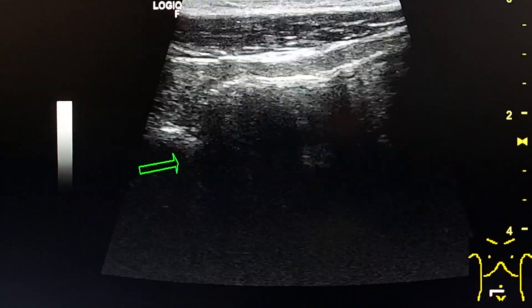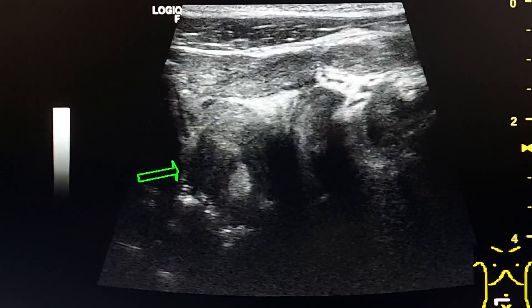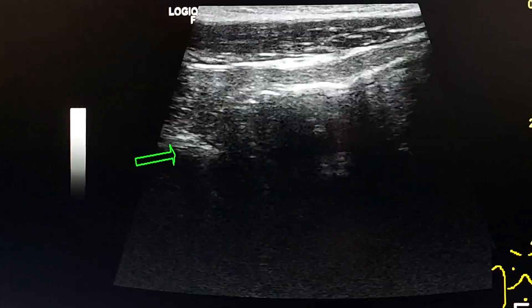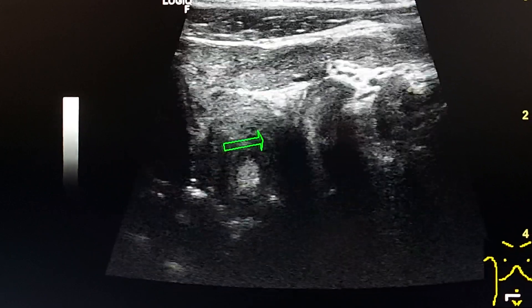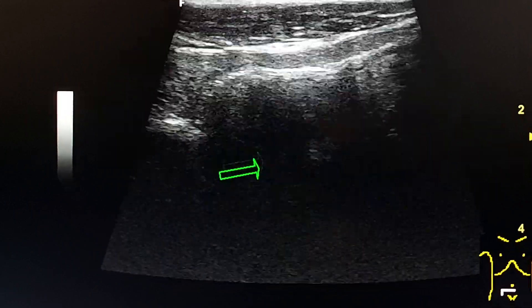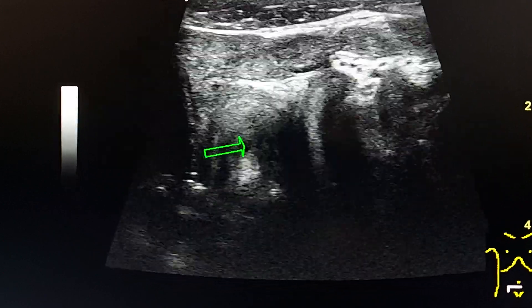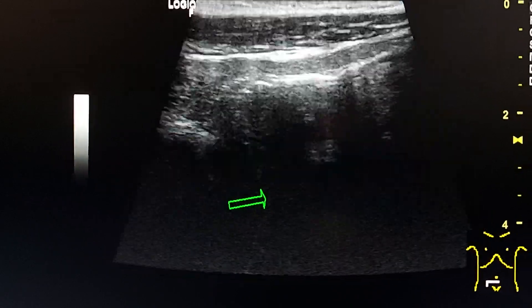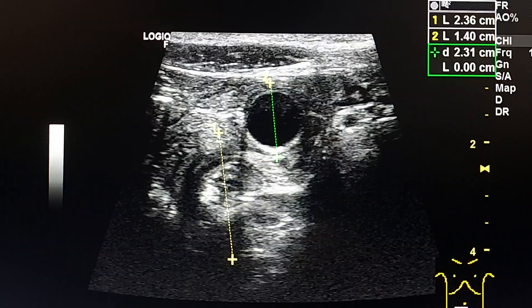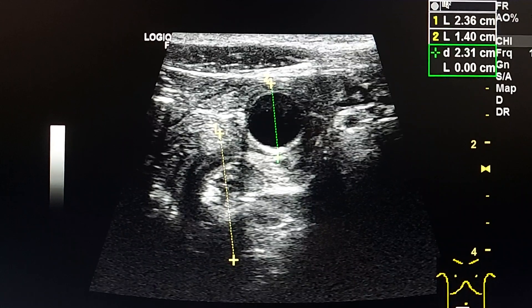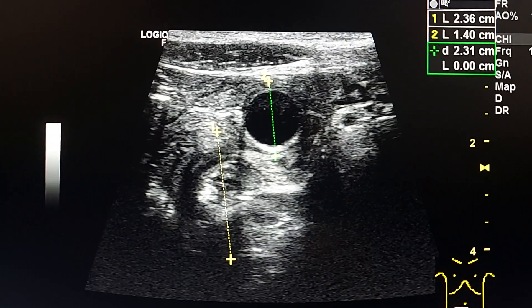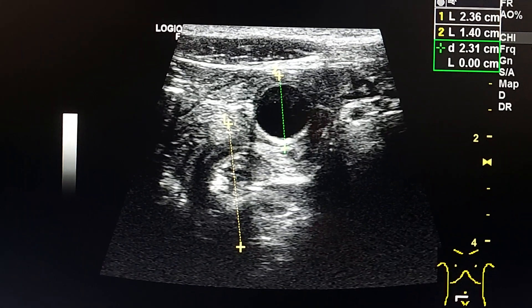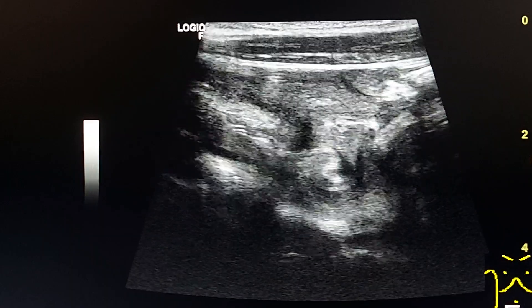Here in the right pelvic area, just next to the right iliac vessels, we see a whirlpool sign — a helical configuration of small bowel loops — which confirms the volvulus. Here we see the whirlpool sign and the diverticulum adjacent to it in transverse section.